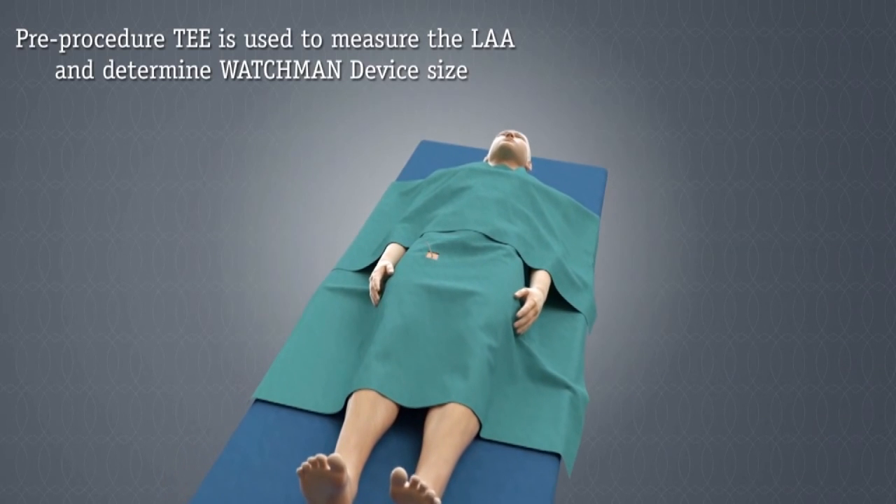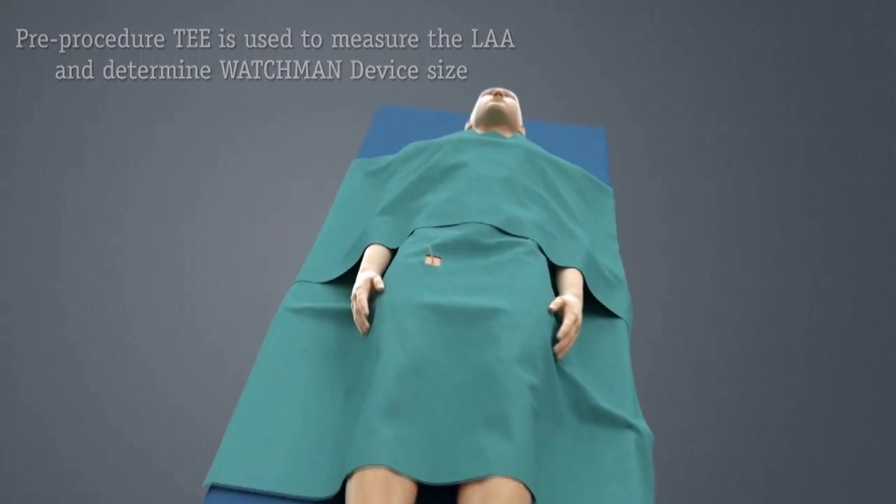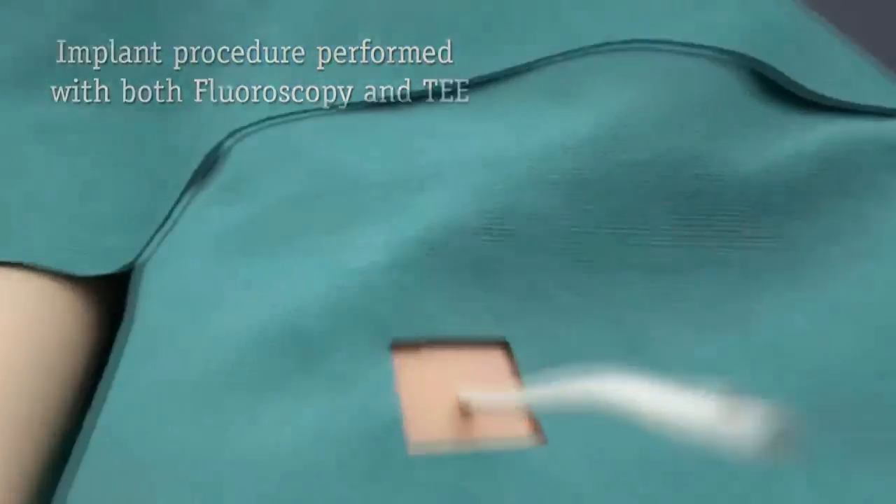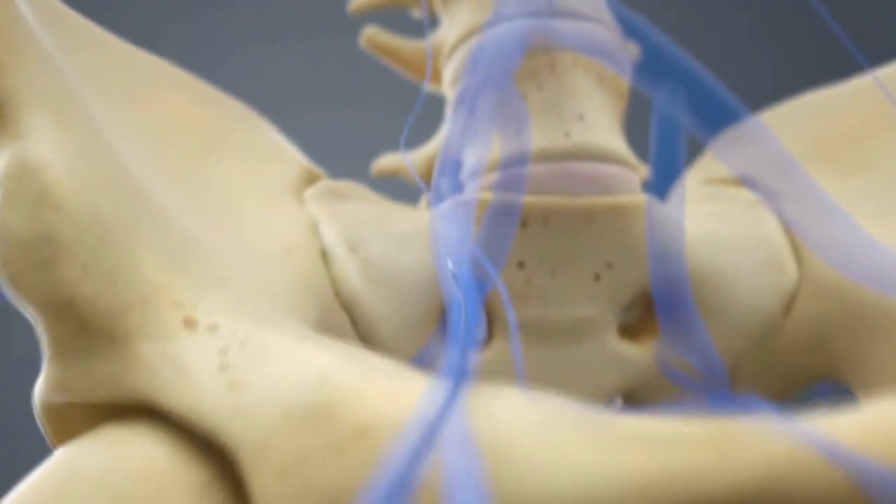If you qualify for this procedure, it is done within the hospital. You will undergo general anesthetic. We will then seek to get access in the right femoral vein and take a catheter up into the venous system.